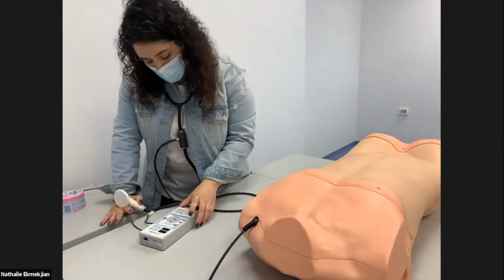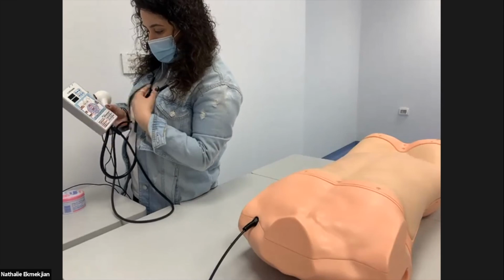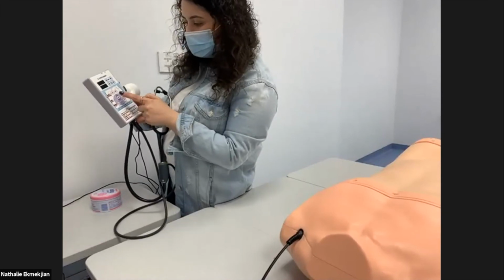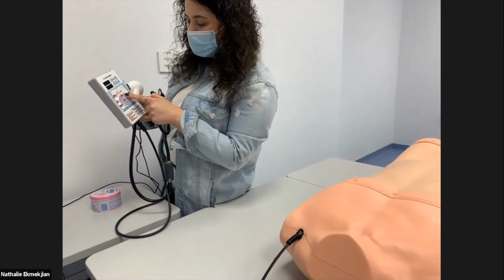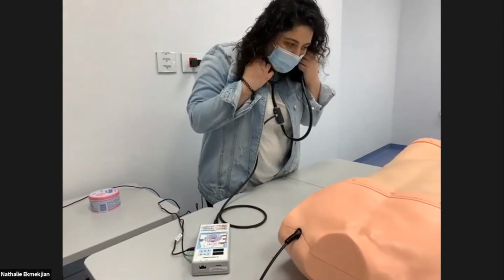So if I want to have obstruction, for example, I press on the bowel and I put for the obstruction number 3. I wait 2 seconds and then click on the bowel. Now we will hear obstruction sound for the bowel.